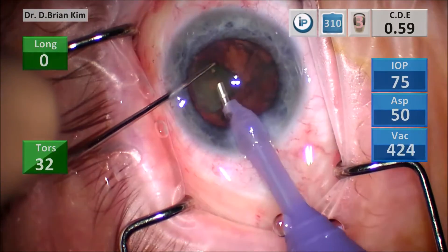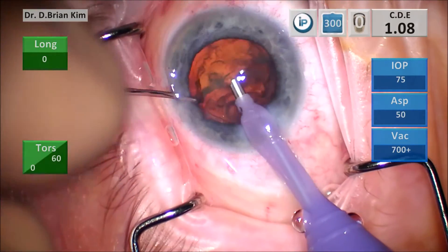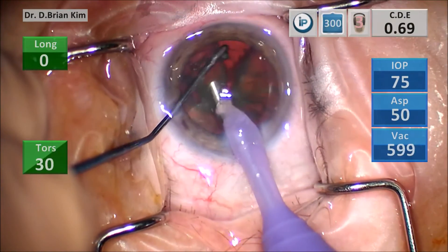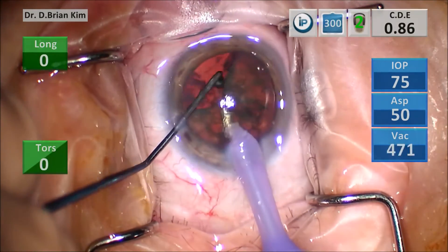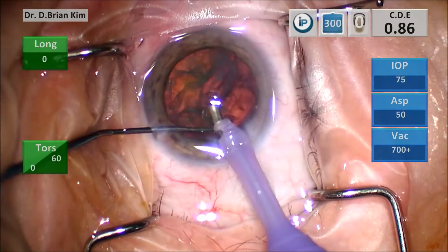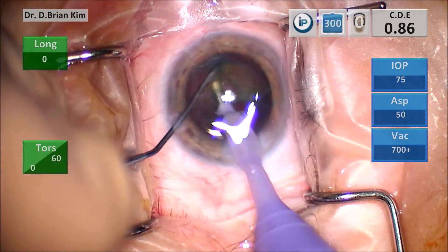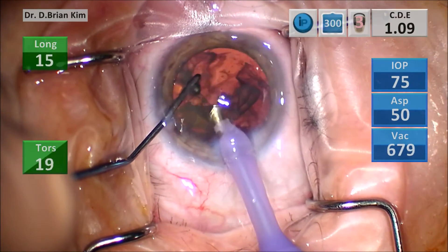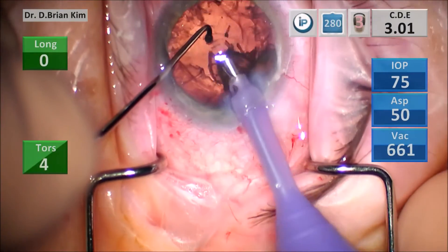People have talked about this jigsaw puzzle effect where the first piece is difficult to remove. Cracking and cracking is not efficient — it just stirs up more debris, making it harder to see. If you just pull that first quadrant out with the chopper, it's much easier. If you find yourself frustrated grabbing one quadrant, just pick a different area and re-chop — you don't have to perseverate.